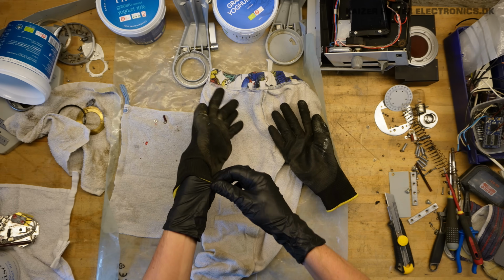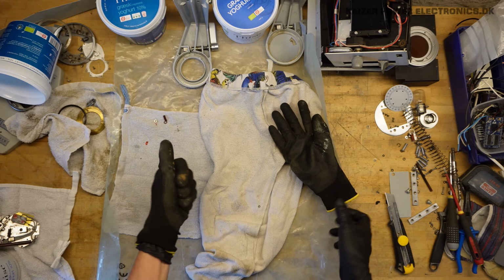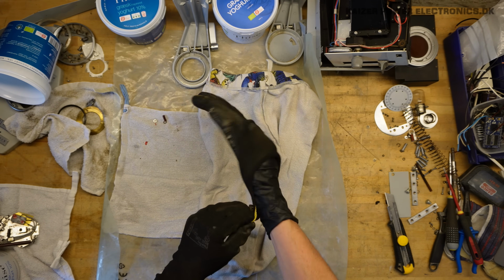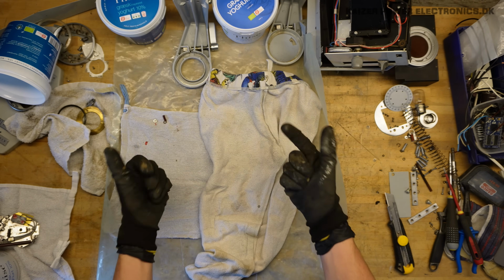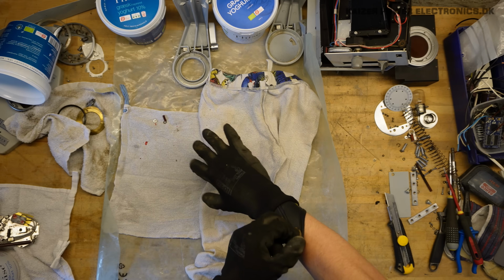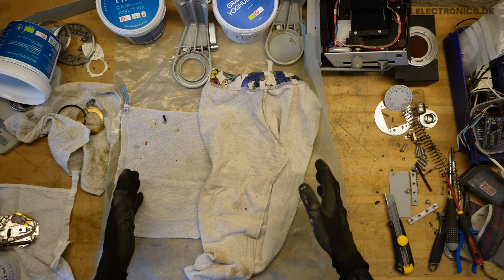You can do some burn tests, but please only do that if you know what you're doing and you won't get to breathe the fumes from it. The best thing you can do is, of course, to buy a PCB oil testing kit to be 100% sure. But we'll wear some latex gloves and working gloves and try not to get oil anywhere else than where we want it.